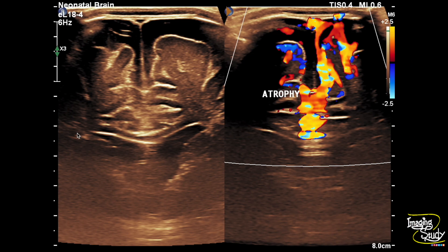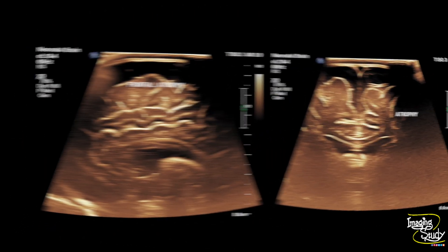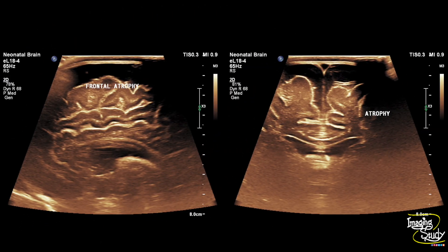Here's the coronal section and you can see the atrophied brain matter. On the sagittal and coronal sections, you can see the prominence of sulci with dilated extraventricular CSF spaces and diffuse white matter volume loss, indicating cerebral atrophy.